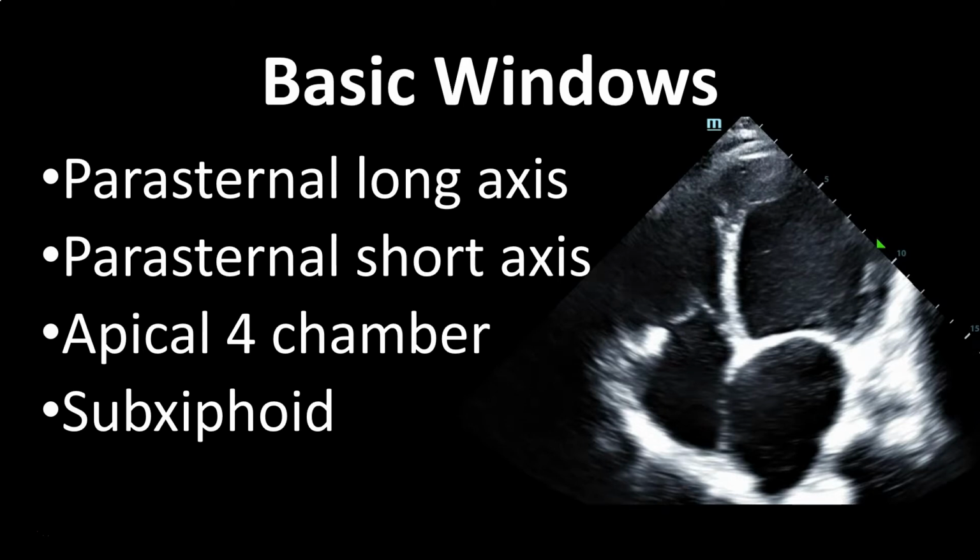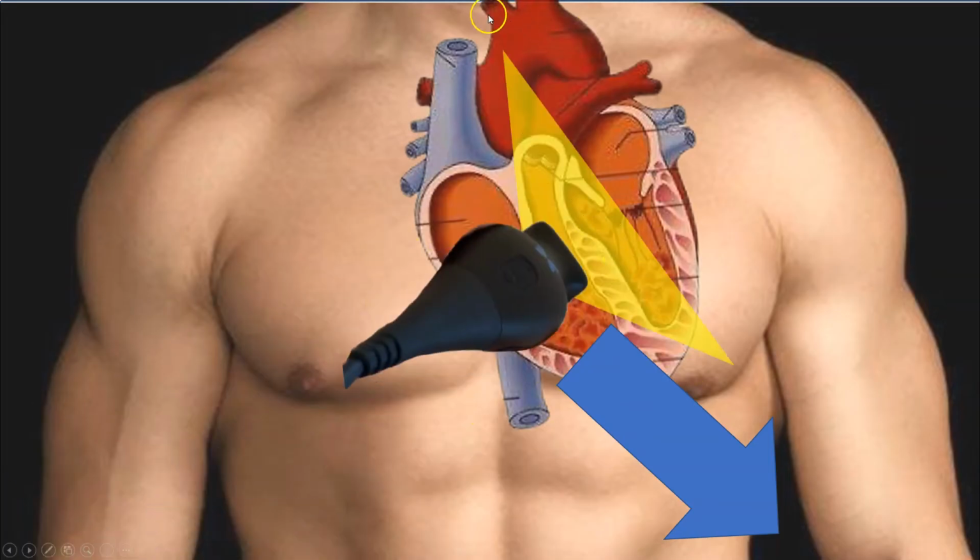So we'll start off by remembering that when you're looking at the patient's heart, right, the heart usually lies in this orientation in the chest. You'd have a parasternal view. Since this is the sternum here, your probe goes next to the sternum, usually.